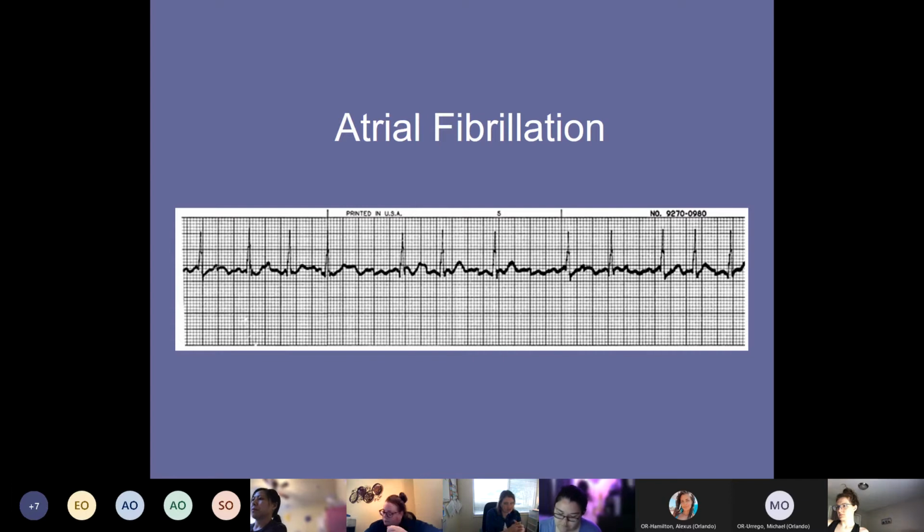In real practice, all the time, we have patients that are either in atrial fib or SVT, and they're really hard to tell apart. In fact, we'll be there with the cardiologist and I think it's this. No, I think it's this. Strips are a little hard to look at sometimes. Okay, I was just looking at the next one and it says we are going to cardiovert them, so that's why I thought the adenosine, because of the cardioversion. Okay, thank you. I'm glad you said that.